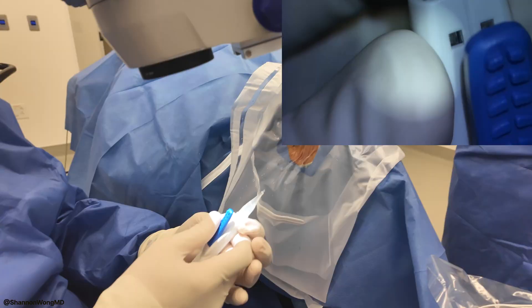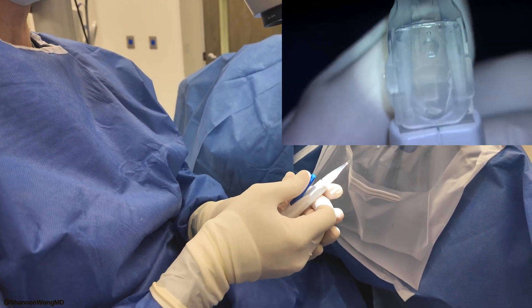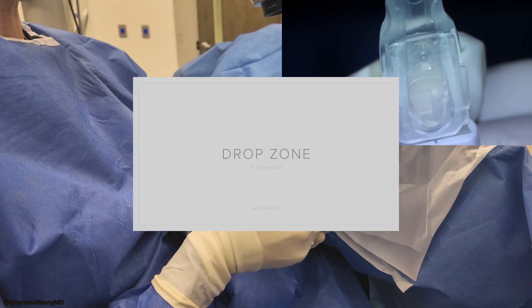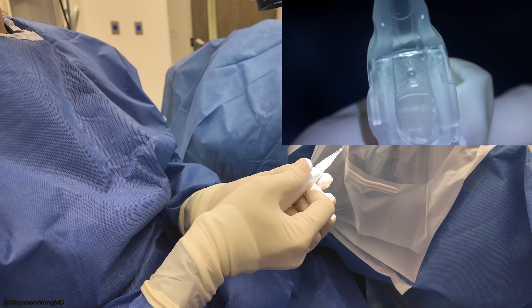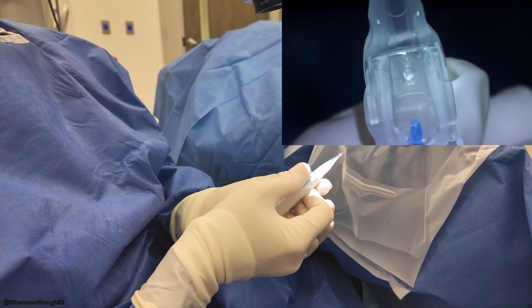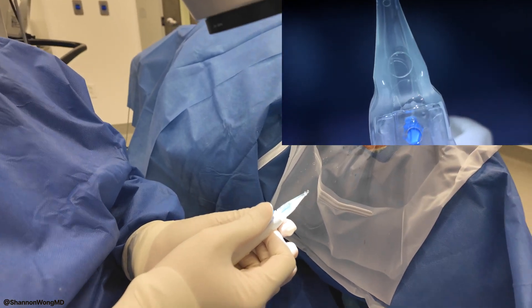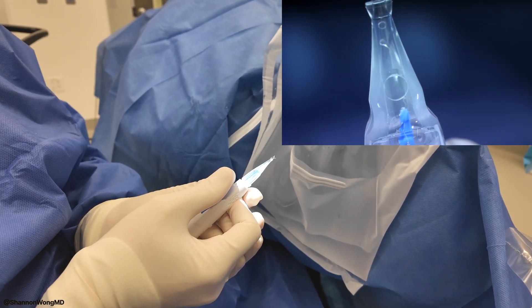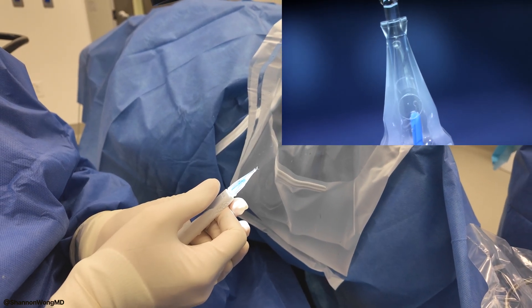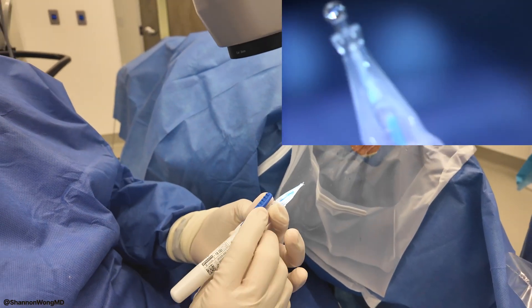So now I depress this and the implant is going to advance because there's some type of CO2 mechanism that will advance the lens. There was a click and now it's advancing. I'm going to advance, then let go — you can control it like that, advancing and releasing in increments.